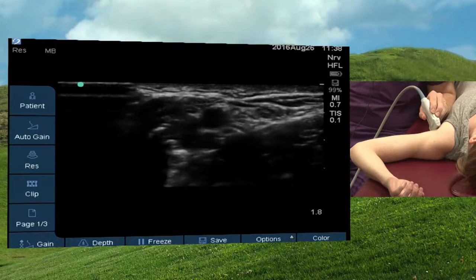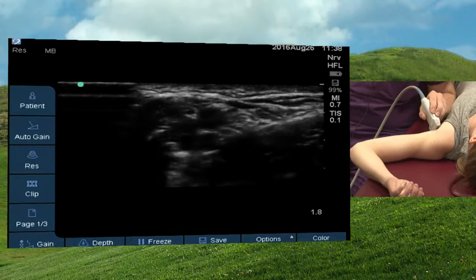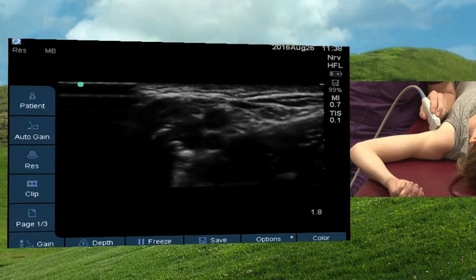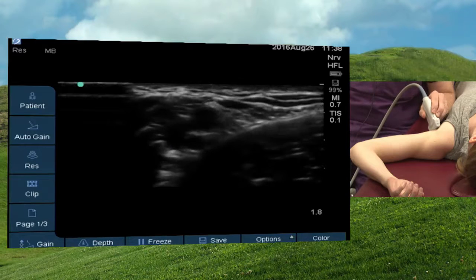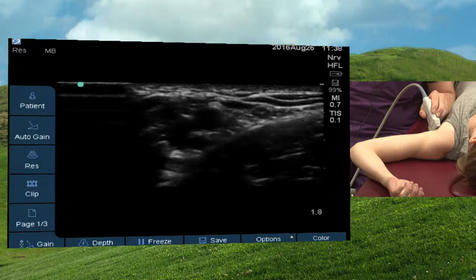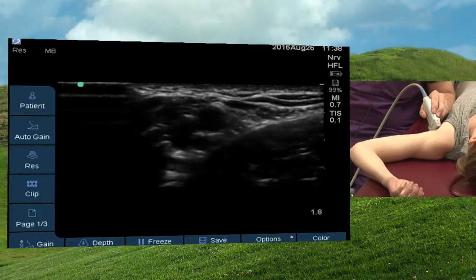It worked, but then you would get the back side, the posterior side of the artery, and then you would withdraw and come back out and again aspirate, and then when it stops aspirating on the other side, you inject more local anesthetic. So that's where we could block any of those nerves that then go down to the hand.